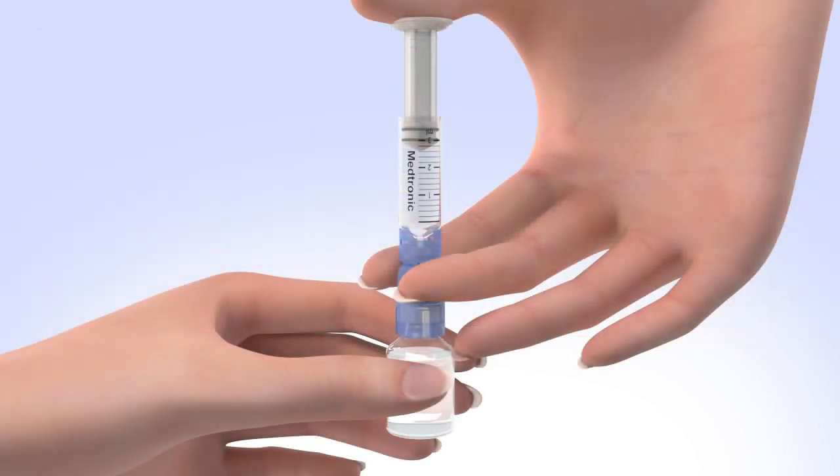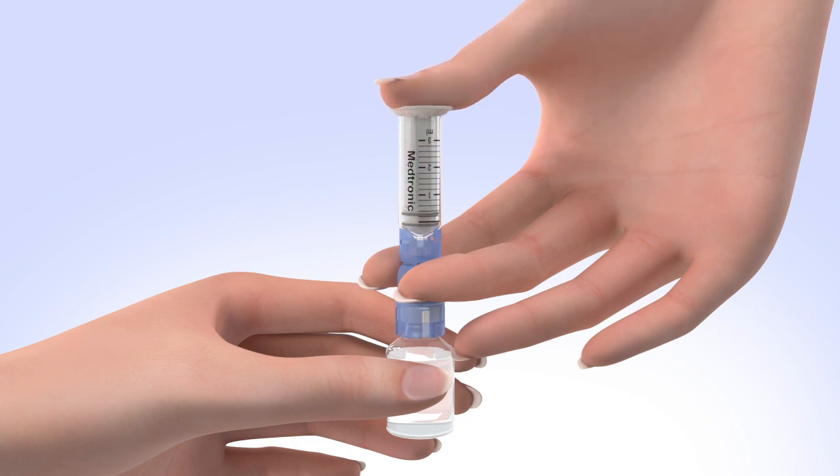Keep the insulin vial upright, place your thumb on the plunger, and firmly push the air from the reservoir into the insulin vial. Holding the plunger with your thumb, flip the insulin vial over so it is on top.